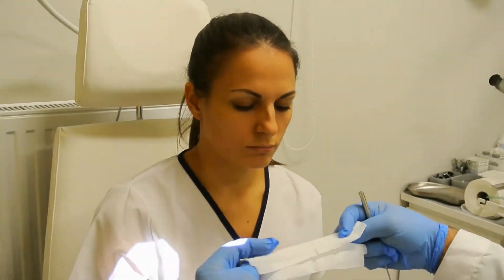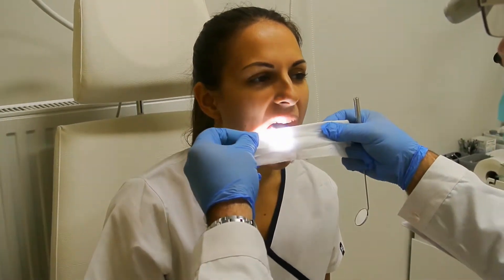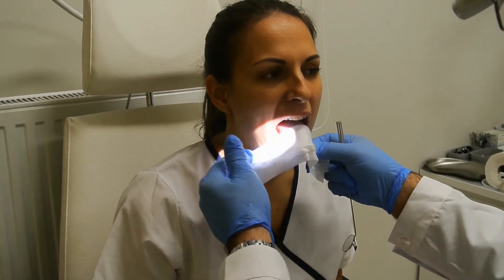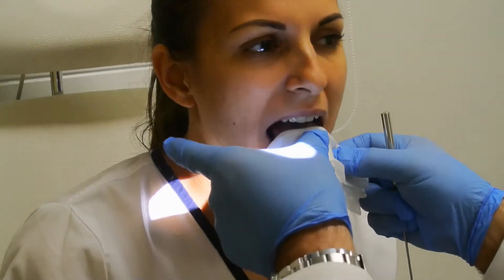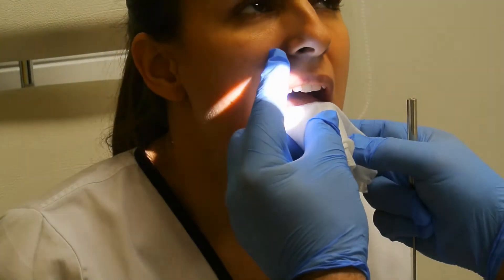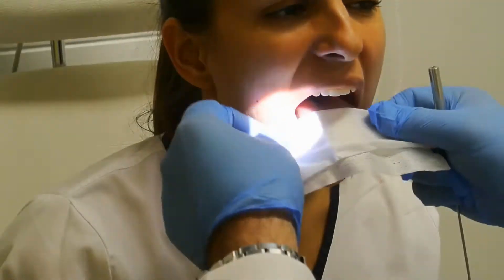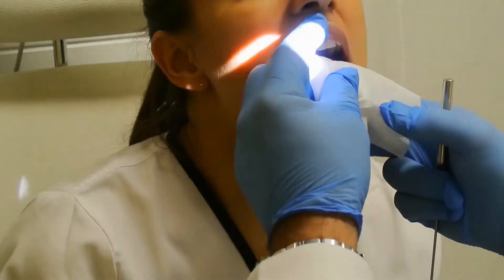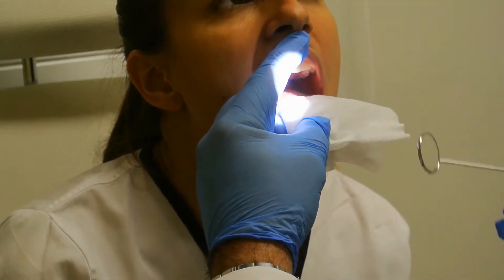Afterwards we get a strip of gauze to hold the patient's tongue. We should do this with our thumb and middle finger. We ask the patient to extrude the tongue and keep it there. It's not advised to pull the tongue, especially not pulling it downwards, as it would cause some pain over the rim of the teeth.